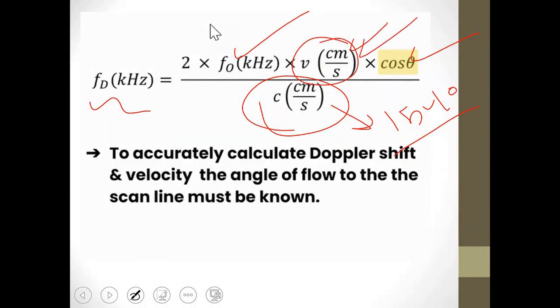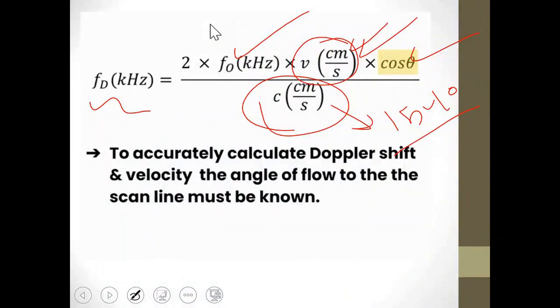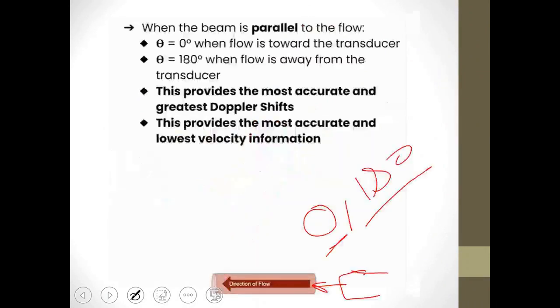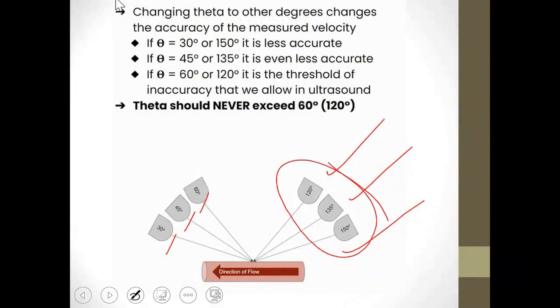Okay, so this is the equation that represents what happened for you. All right. Here, as we said, 45 and 60 are the angles on one side, while on the other side, they are 150, 135, and 120, so you don't get confused. It's nice how you say the angles according to the direction of the blood flow.